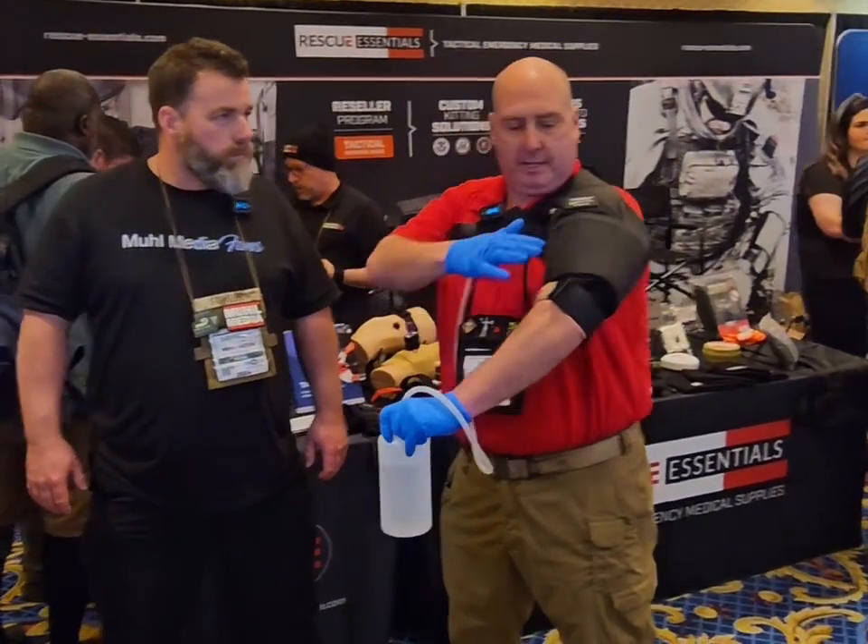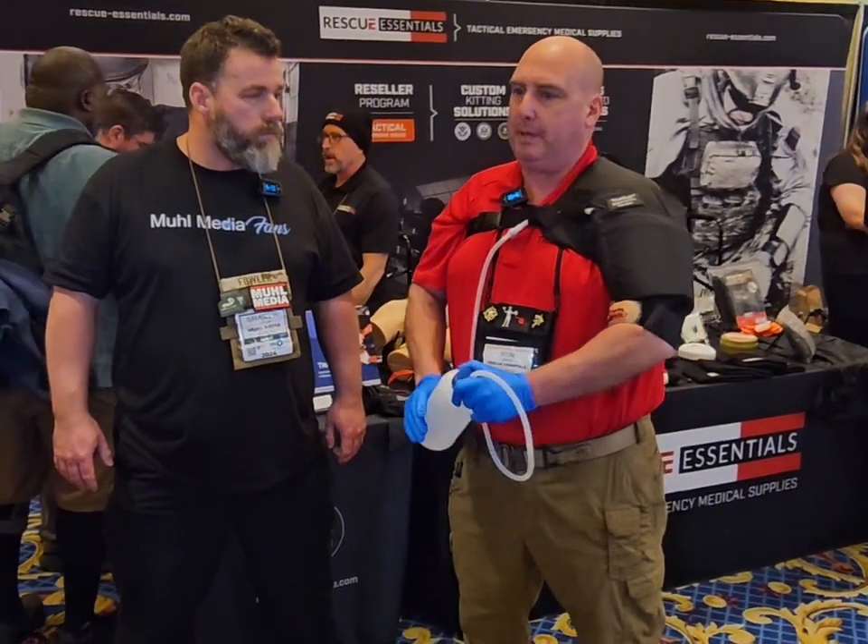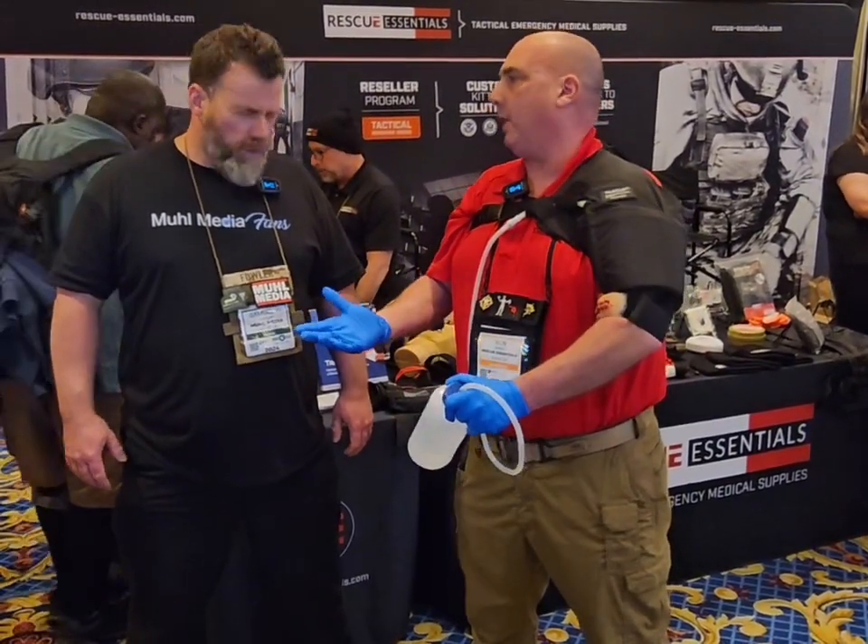One of the benefits of this tourniquet trainer is the padding on the back here. One of the biggest complaints we see when people are doing tourniquet training is that it hurts.